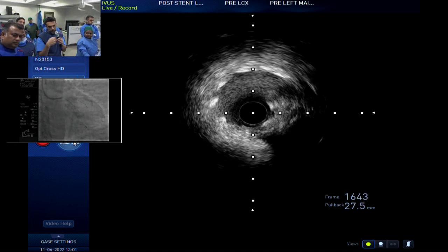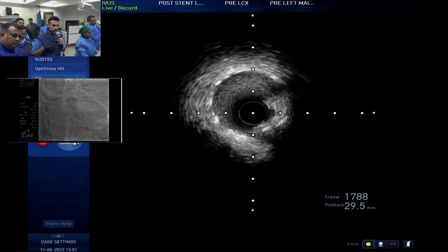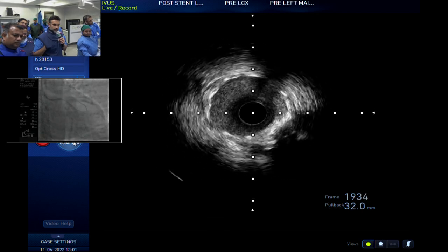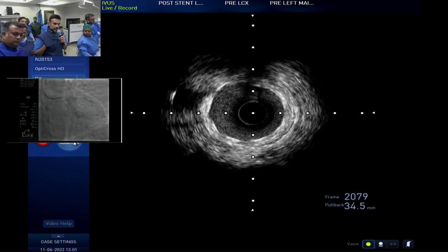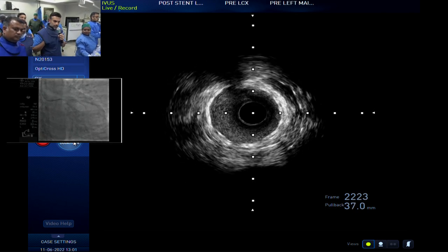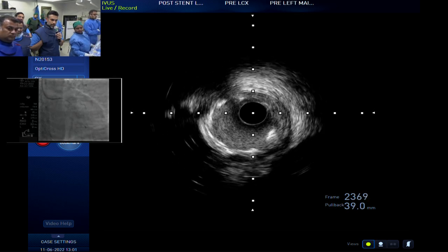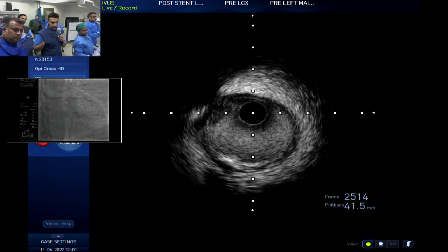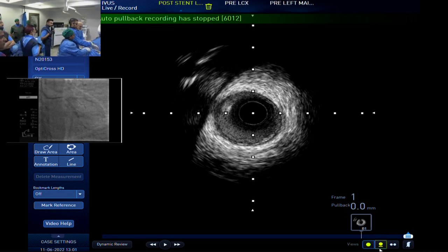This is where you took up a 3-0, and I'm sure you can agree that it's a nice looking vessel there. There's no substantial plaque prolapse. Here comes your proximal edge. You came across a branch. And drum roll. So this is where the proximal struts, where we left them. We didn't post dilate those, and there, you're done. Perfect landing. Lovely. Nice. Very good. You're finished. We will take one nice view.